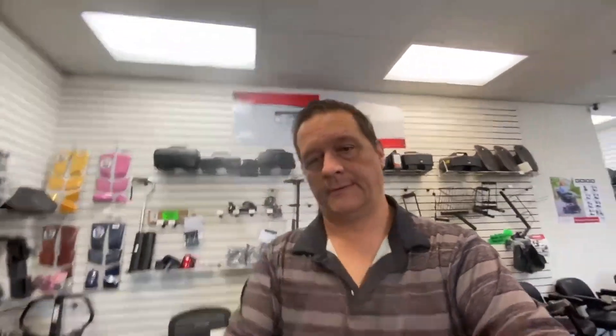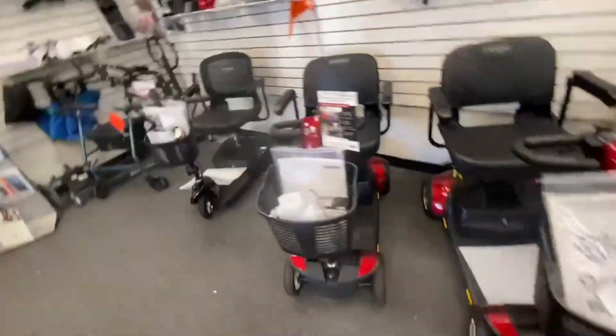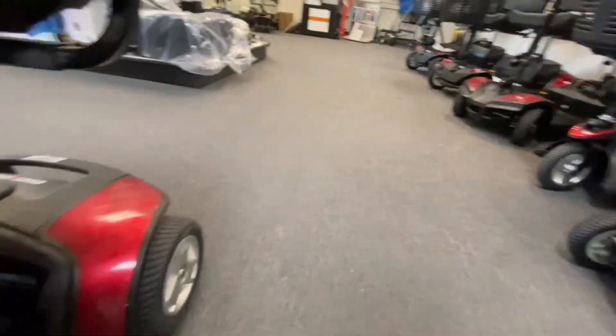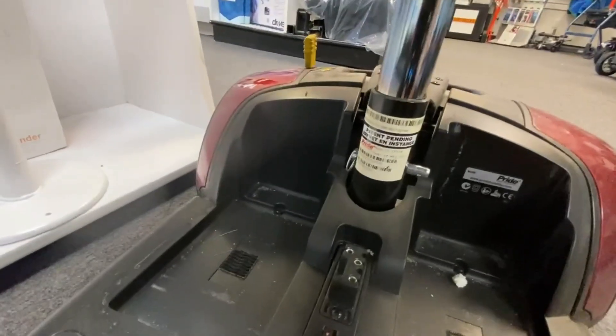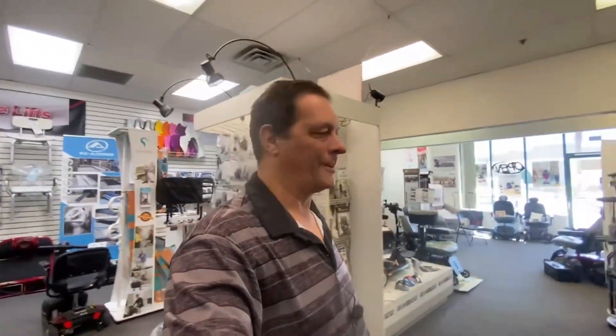Nine times out of ten it's either batteries, or they've left the charger plugged in, or the brake levers are undone. Have your serial number available if possible — you may find it on your paperwork or user manual. With Pride products they actually put the sticker on their user manuals. On your scooters I'll show you — just there is your serial number. With the serial number we can look it up and tell us exactly what model of scooter it is. It will also tell me when it was manufactured and what other work has been done on that scooter in the past if it's a used scooter.